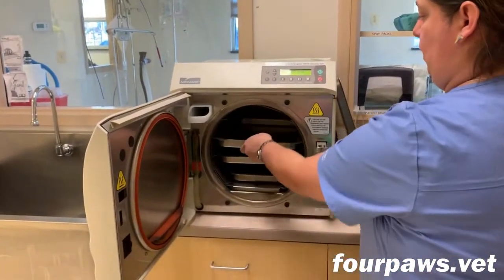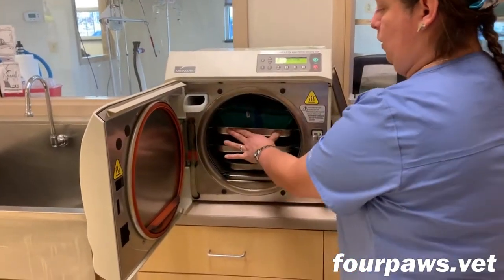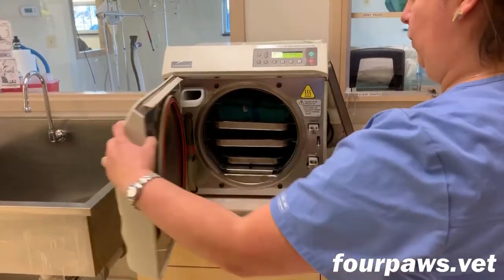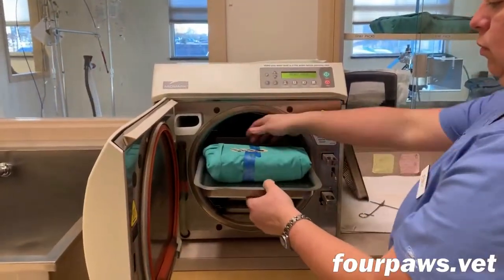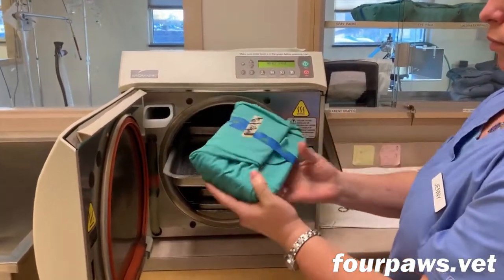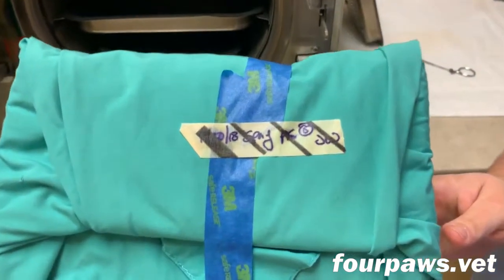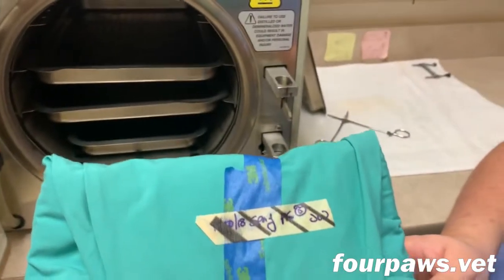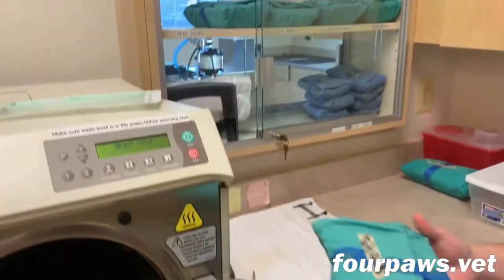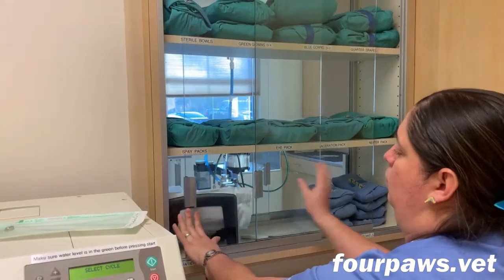Once the packs have been prepared, they're loaded into the autoclave for the sterilization process. Once the autoclave is finished, the packs are removed, and you can now see that the indicator tape on the outside has some black stripes on it. This lets us know that the sterilization cycle was completed properly. I hope you found this interesting and we look forward to seeing you soon.